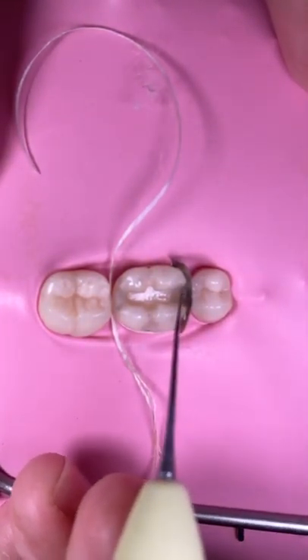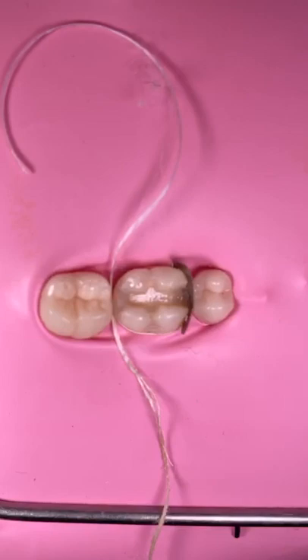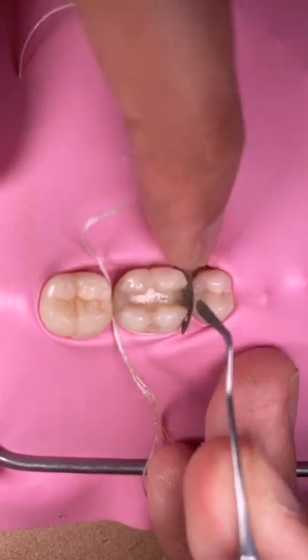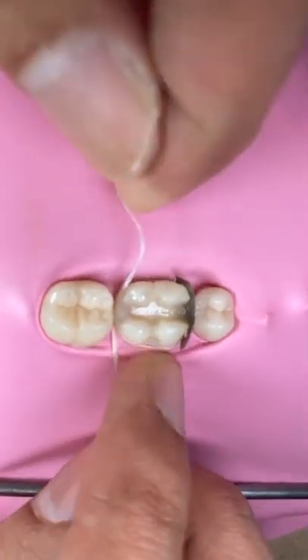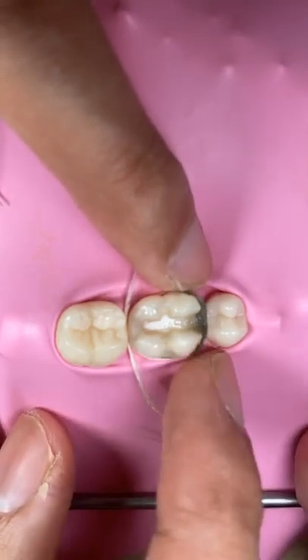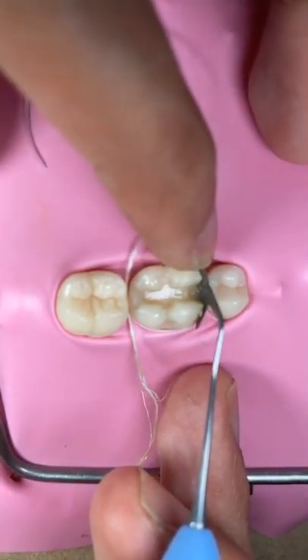Take your spreader or sharp instrument to spread flowable all over the surface. Yeah, and the idea is just to seal all the surface, and you want to make sure about the marginal. You can use your forceps, yeah, to make it round on this side, or sometimes I just push in this area. Okay. So time for curing.